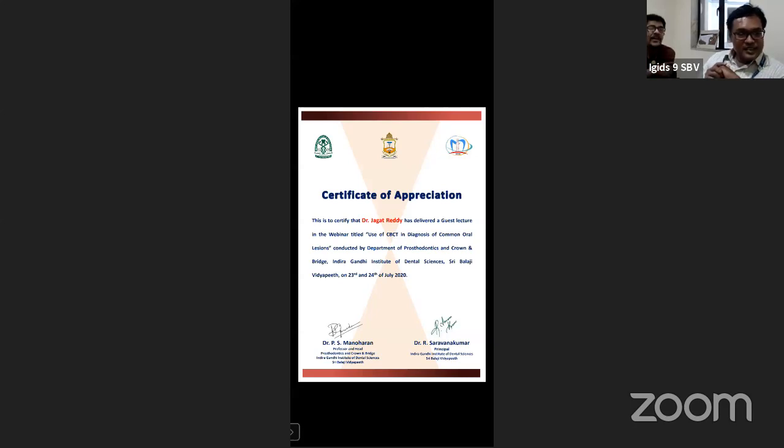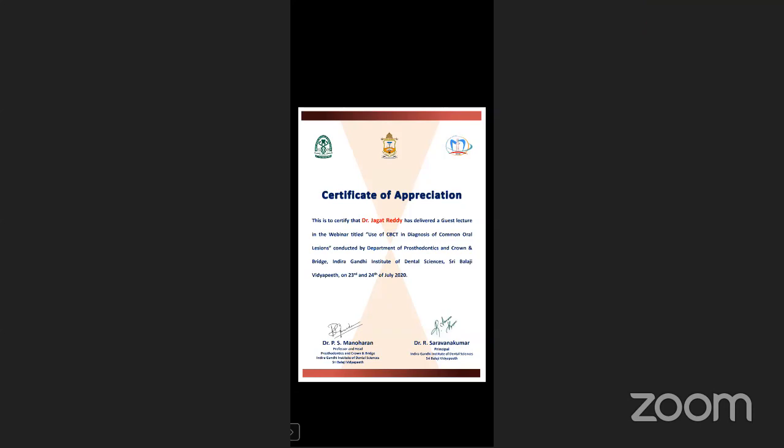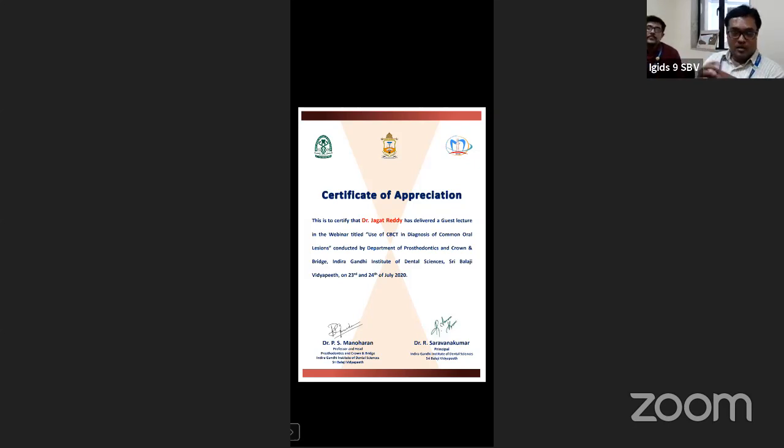Dr. Santosh, our alumni, has asked: are metrics measurements approximate on CBCT, or is there a magnification factor? That's a nice question, Santosh. Metrics and measures on CBCT today are perfect to the millimeter, with submillimetric precision. The earlier generation CBCTs had a little problem with pixelation in the midline structures.